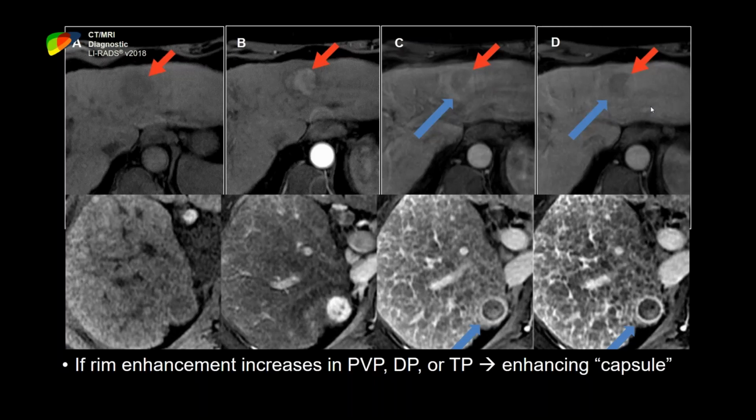Thank you for the very nice discussion. I have a more general question. Do you prefer extracellular or hepatobiliary contrast agents when using LI-RADS, or do they both perform equally? What are the pros and cons in your experience? Victoria, you're laughing, so you answer this question.